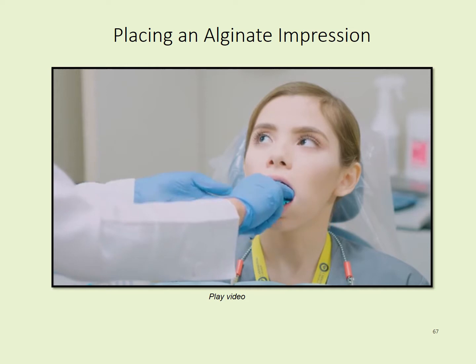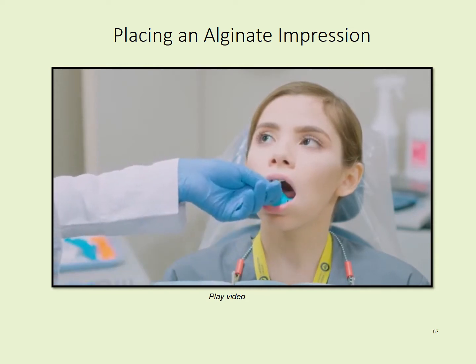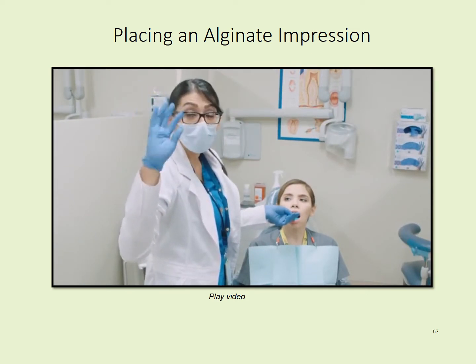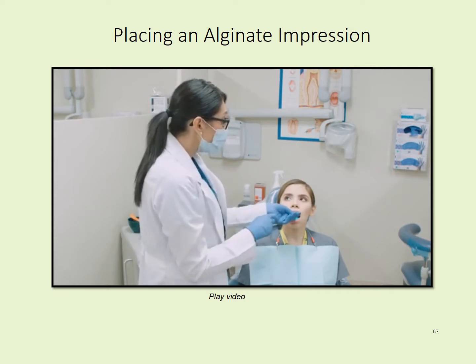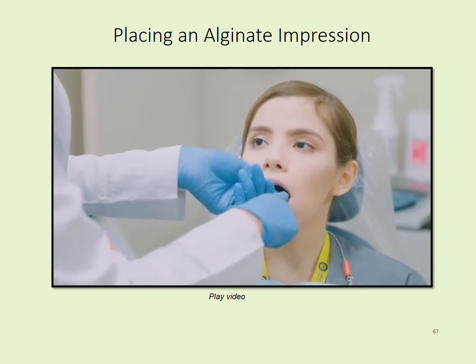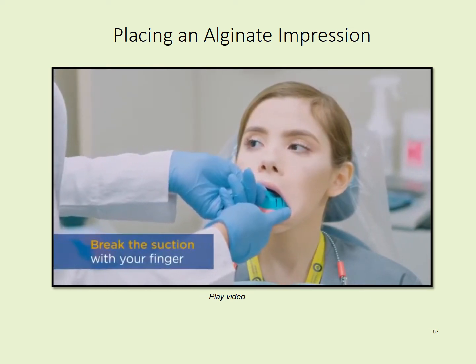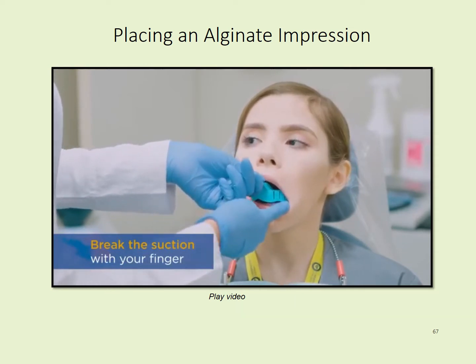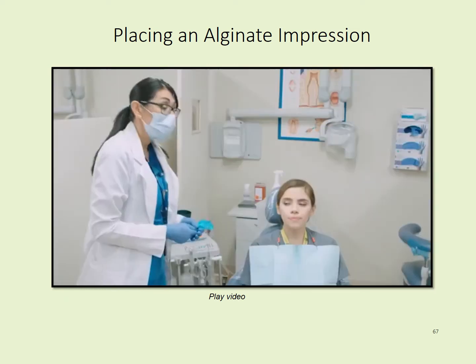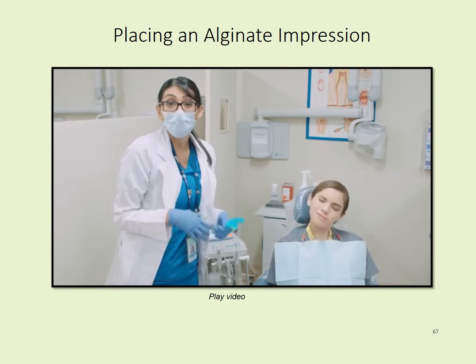I'm going to go ahead and switch fingers and hold this tray with my hand. I'm right-handed. You probably want to use the hand that you're most dominant with, right-handed, left-handed. And so I go ahead and switch positions. I hold the tray like this, take my index finger, go into the mouth, under that vestibule, and at the same time, make an air bubble, and then wiggle that tray up and then outside the mouth. So now we are going to try the impression with the material inside the tray for placement and removal.